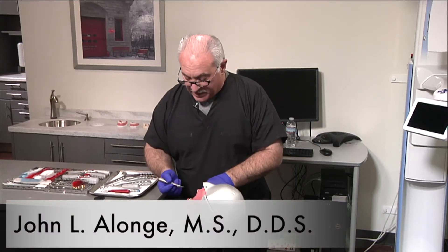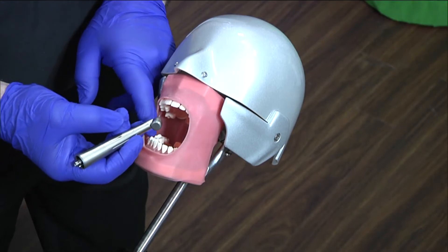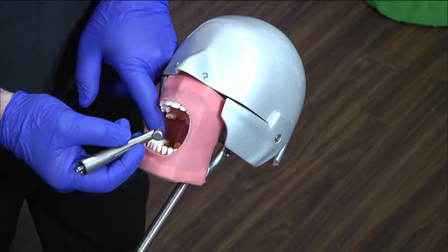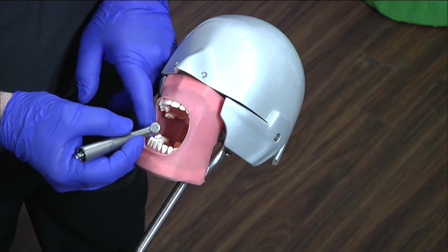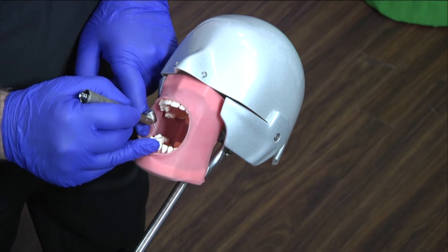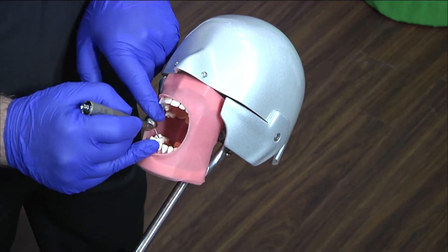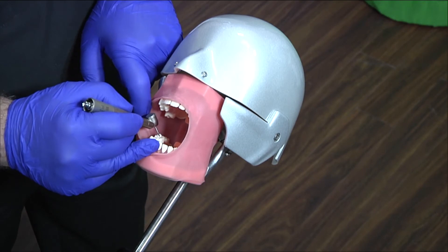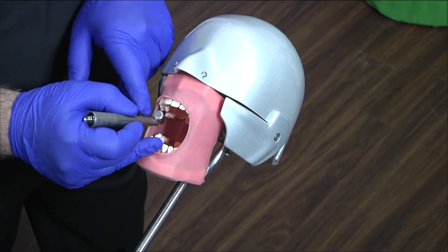I'd like to show you the 45-degree angle handpiece. There are many companies that have them out there — I believe there's one now that has just introduced one for electric. The whole point is you have better visualization because of the angle, and all of the air is vented out the hose end, not into a wound when you reflect the flap. You're into a fascial plane.